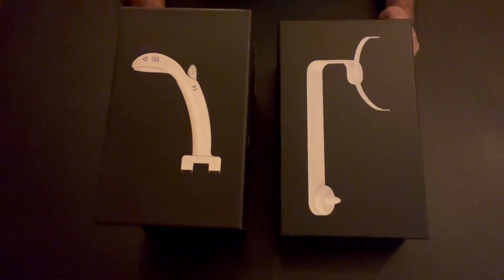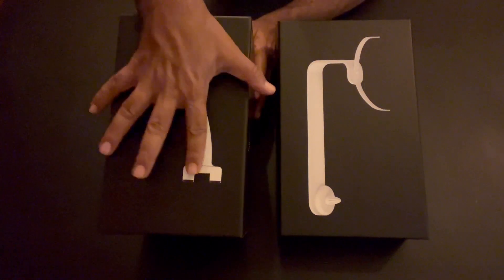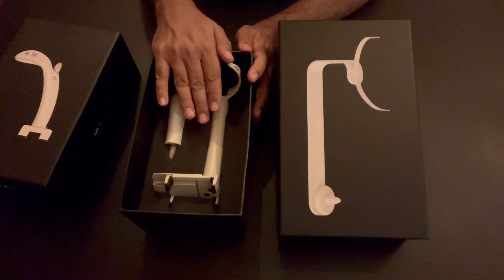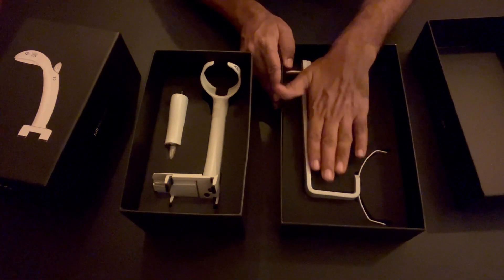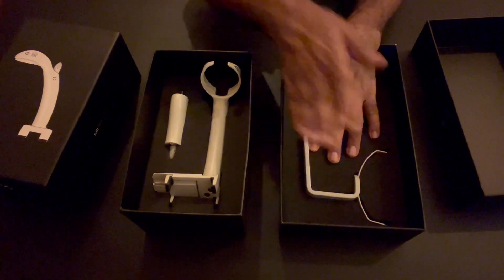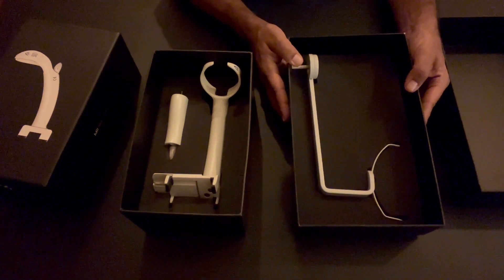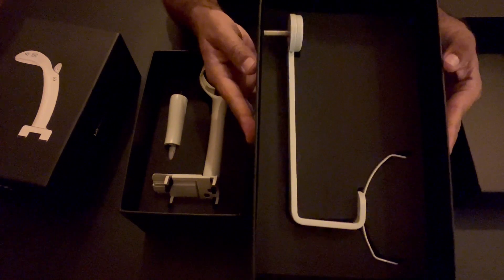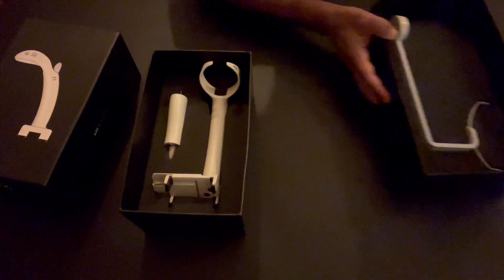Hello dear friends, in this video we will unbox the latest version of the handheld mi red cam and slit lamp mount. This is the handheld mi red cam, and this is the slit lamp mount. The slit lamp mount is used to mount the same handheld device so that you can use it in a much more stable manner. The slit lamp mount does not require any assembly — it is used as such.